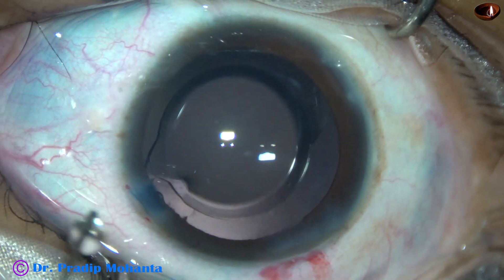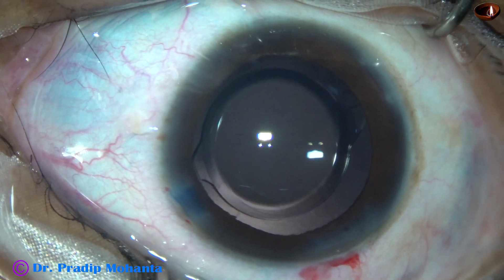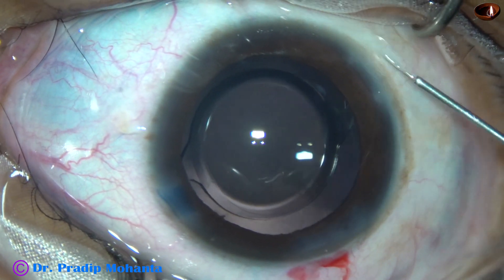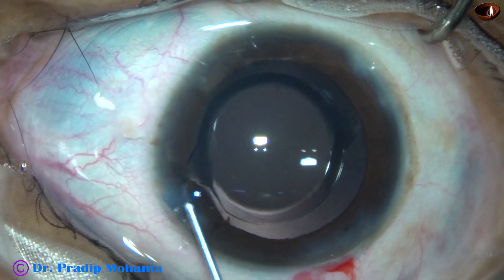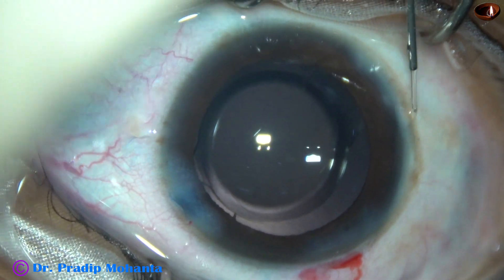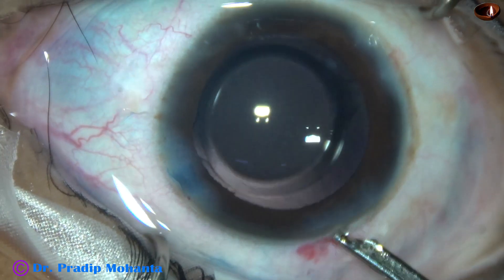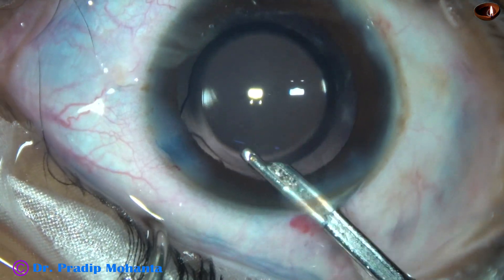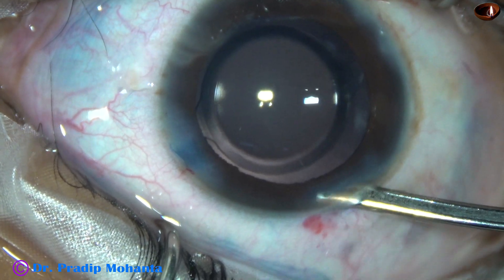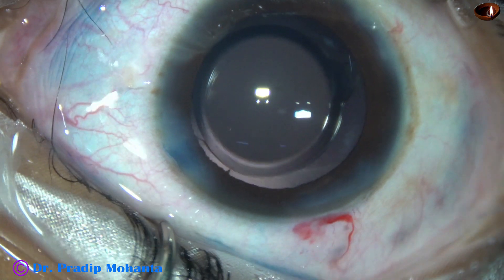If you do surgery meticulously, the patients will be very happy. If you don't take much care removing viscoelastic, there can be raised intraocular pressure the next day because of retained visco, and the patients will not be happy. So always give some quality time when you remove the visco. This may take longer than nucleus management in soft cataracts. If you can do hydroimplantation, then this time is saved to a great extent.